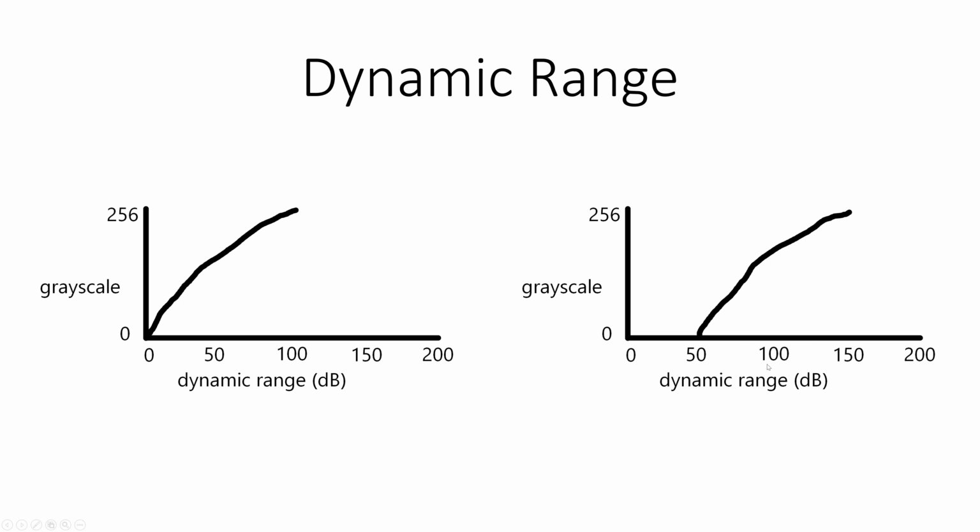So both of these compression curves, if you were to look at our fancy Mindray that gives you an actual number for dynamic range, the dynamic range number is going to say 100. But the images are absolutely not going to look the same. The curve on the left, you're going to see a lot of echoes that are of less intensity, quieter sound, get assigned some grayscale numbers, get assigned some gray pixels.